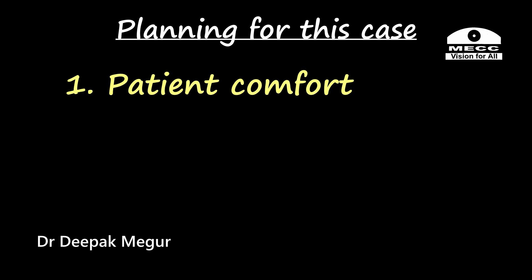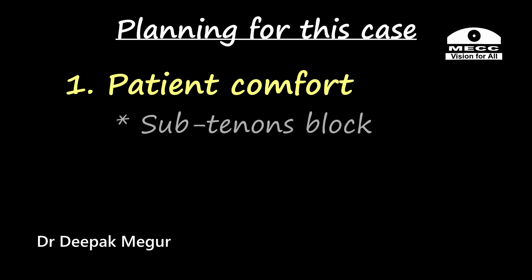This was my game plan. The first goal was to ensure that she is comfortable with very minimal sensation and some form of akinesia preferably. So I decided to give her a sub-Tenon's block. This was a rare event for me since I had not done any toric patient with a block, because my concern was that sometimes we don't get the patient looking at the light — the eye turns out somewhere else and that causes an issue.